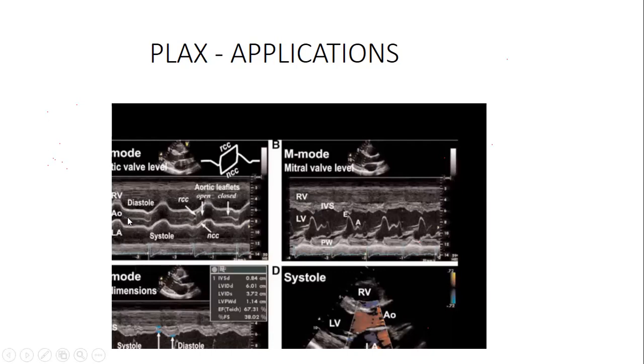Why are we having this line here? The reason why we have this line is because the heart muscle is in diastole. The left ventricle is filling. Remember, when the left ventricle is filling, the mitral valve is open. And when the mitral valve is open, the aortic valve cannot also be open. It's closed. That's why we are having this line. The moment it goes into systole, the aortic valve will open. That's why they have put systole here. It will open. Very important to understand that part.